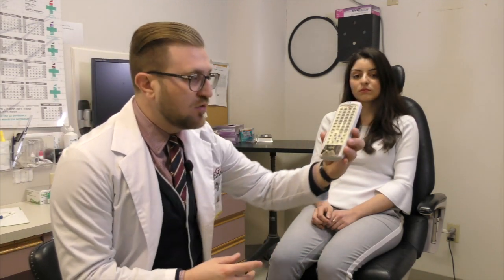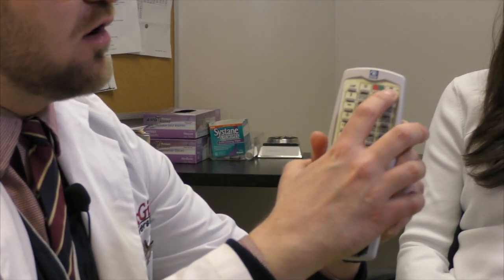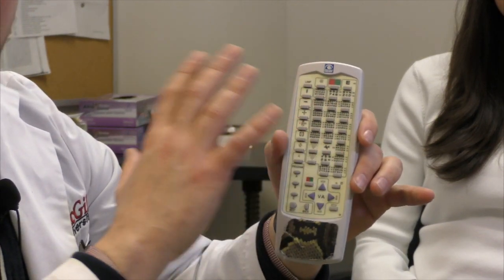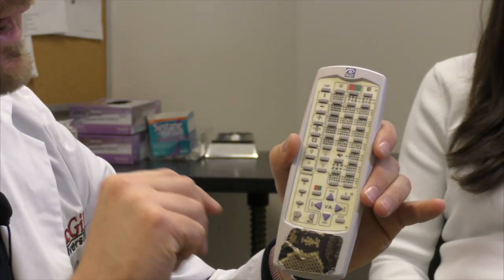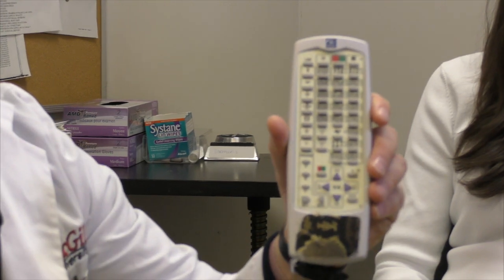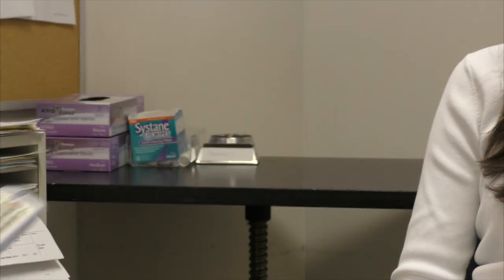Most of the time in the exam room, there are mirrors that get the distance correct, so you're ready for a proper examination. To begin the exam, I take my remote here for the digital projector. There's a button on the top that turns the projector on and off. On the right side, there are buttons that will highlight a specific line — either 20/30 or 20/25 — for the patient to read. We like to test line by line; going by a single line is the best way to test visual acuity.